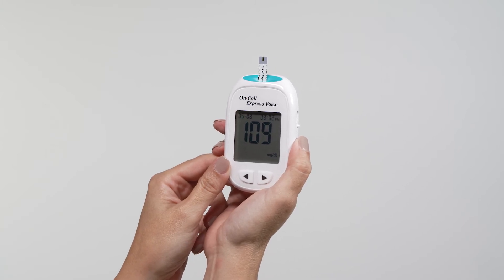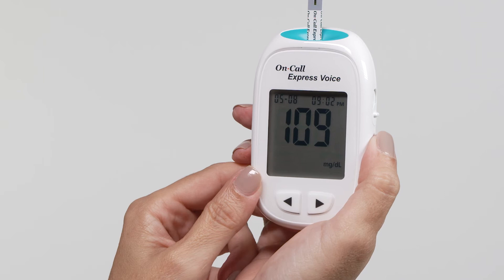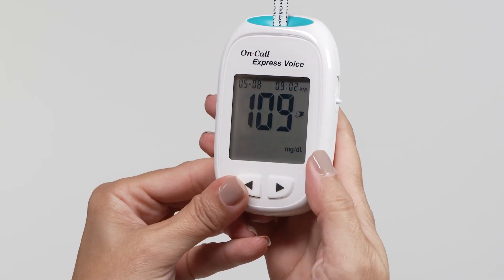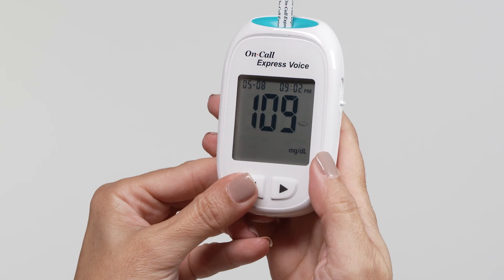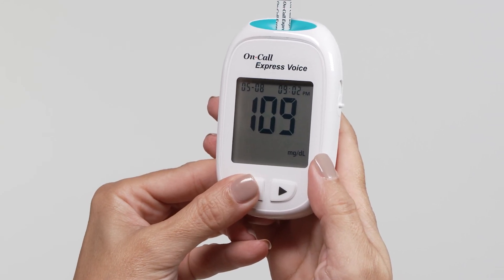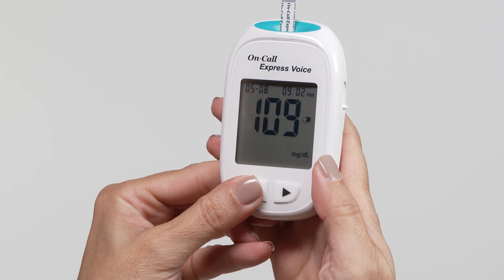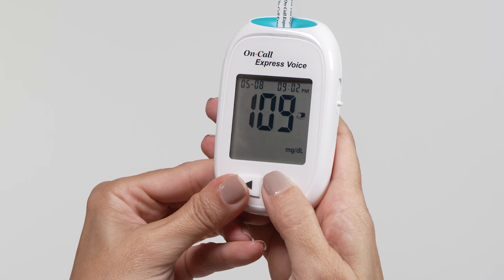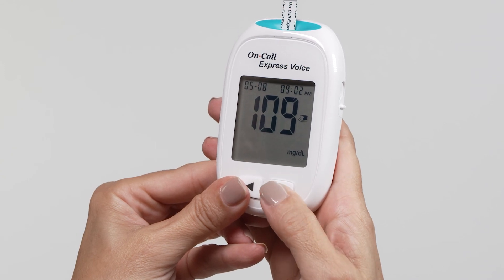Blood glucose results are automatically stored in the memory. Press the left and right button together, then press the left button to switch the marker from before meal, after meal, no marker, or invalid result. After deciding the selection, press the right button to confirm the selection for either before meal marker, after meal marker, invalid result with pound sign, or none of these three symbols.